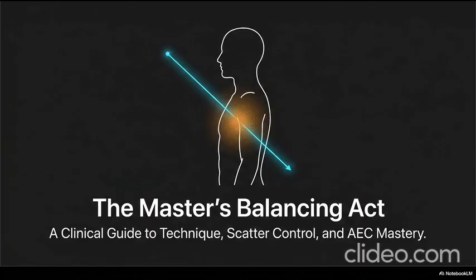Man, that's frustrating. So what triggers this billiard ball effect? According to the notes, three main variables drive scatter. That's right. The first is what we just talked about, high kVp. A more powerful beam creates more chaotic, high-energy interactions inside the body. Right. The second is patient thickness. I mean, a larger body part simply gives the X-ray photons more human tissue to bounce around inside. Makes sense. And the third variable, which is actually the one the radiographer has immediate control over, is the size of the irradiated field itself. The actual size of the beam. The wider the X-ray beam, the more tissue it interacts with, generating exponentially more scatter.